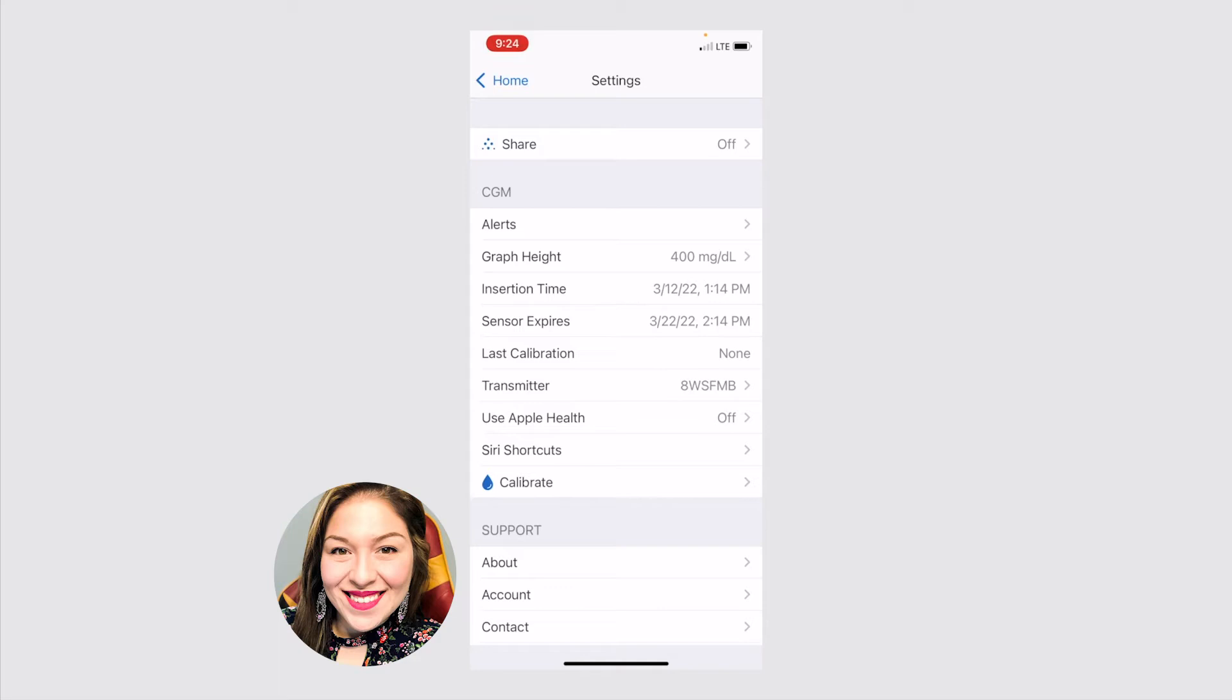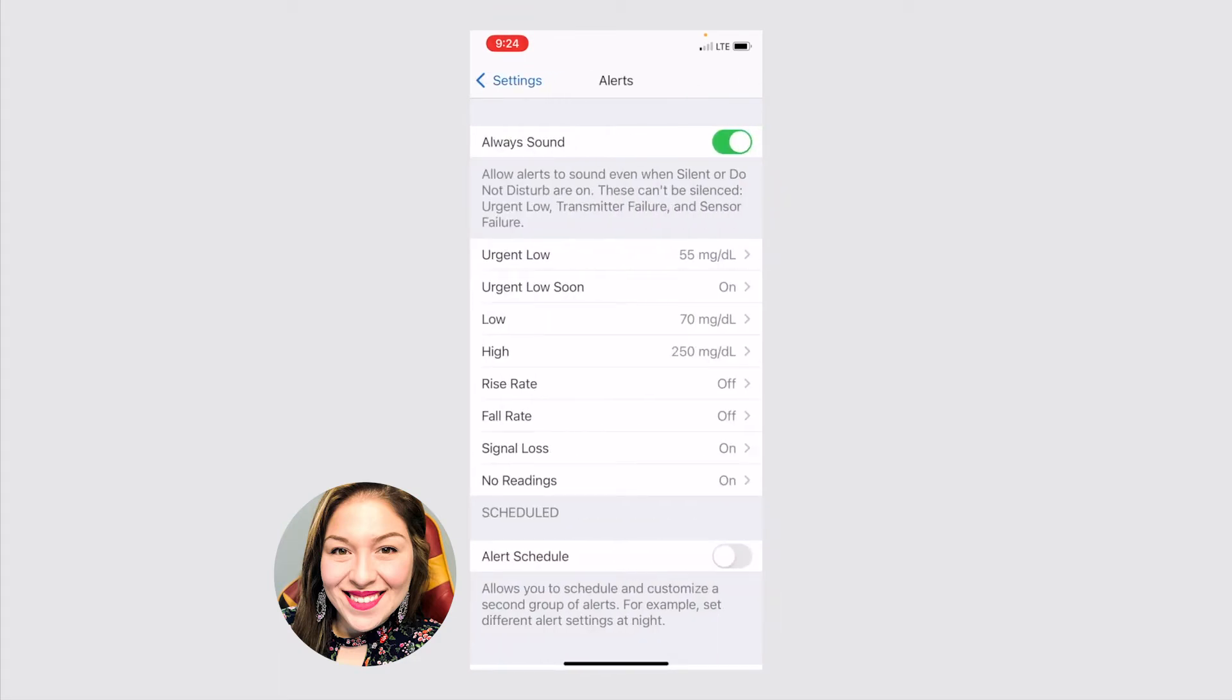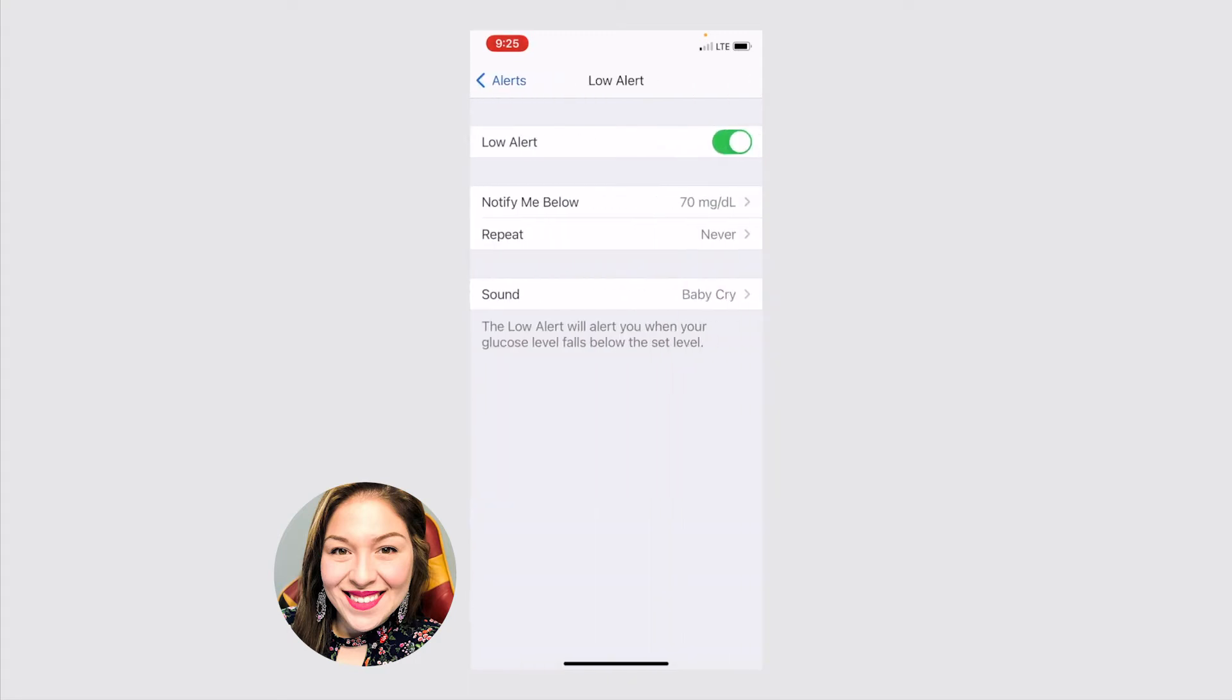Some other options are your alerts. It's always good practice to always have them on. So you can hear when your sugars are going low, if they're going high, if there's any issues with your sensor, which is really important to know. And you can adjust these. This is really important to know. You can personalize it to your settings because your threshold for low and for high is going to be different for you than it is for another person with diabetes.